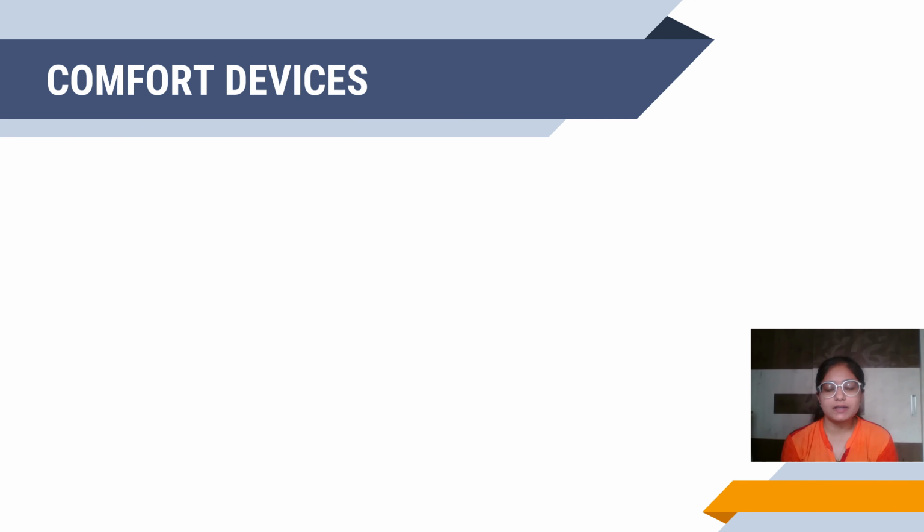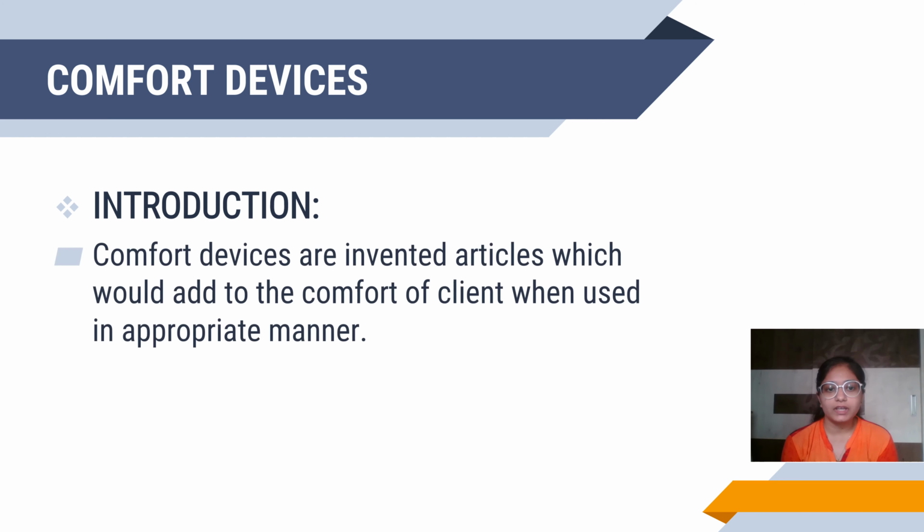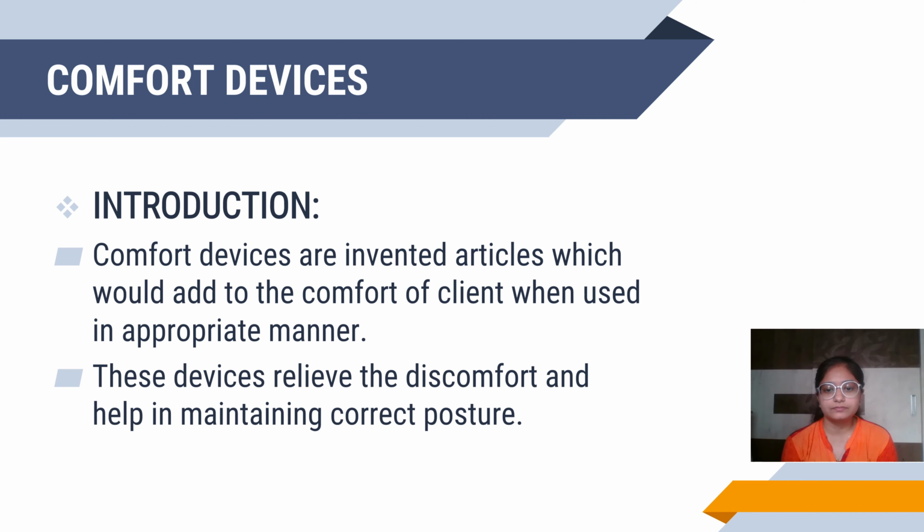Now we will discuss comfort devices. Why are comfort devices important? Introduction: comfort devices are invented articles which aid the comfort of the client when used in an appropriate manner. Basically, comfort devices are mainly used to provide comfort to the clients. Comfort devices relieve the discomfort of the patient and help in maintenance of correct posture.